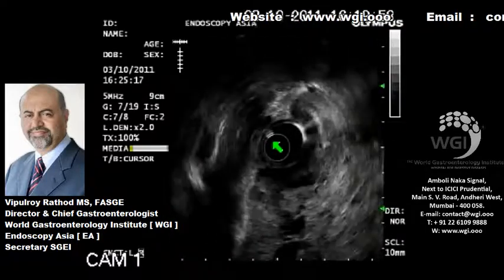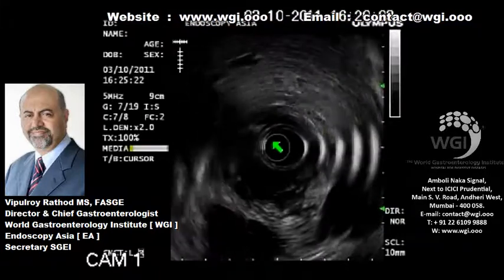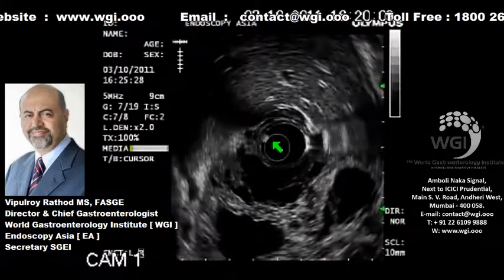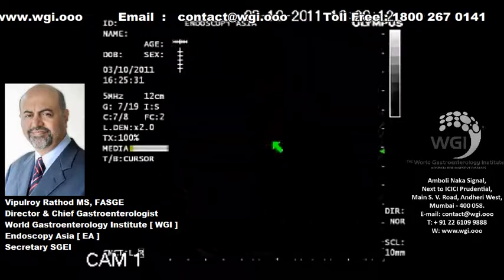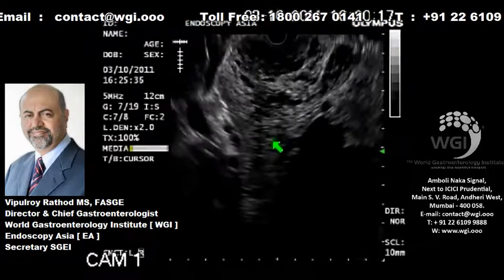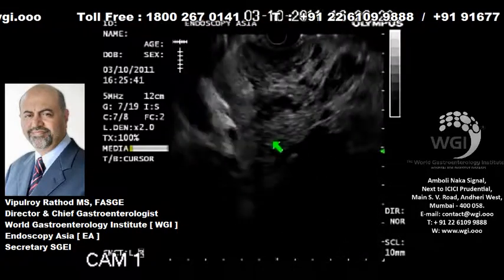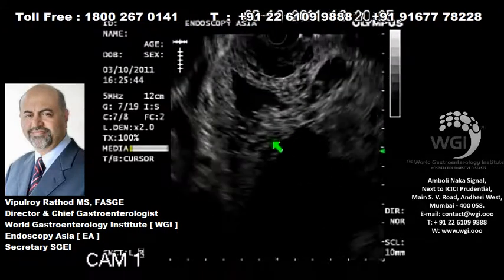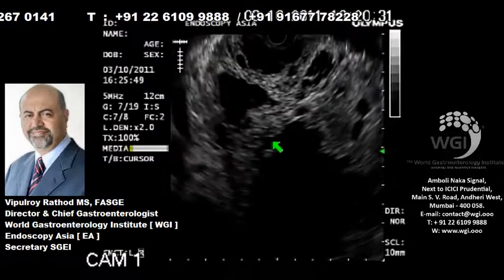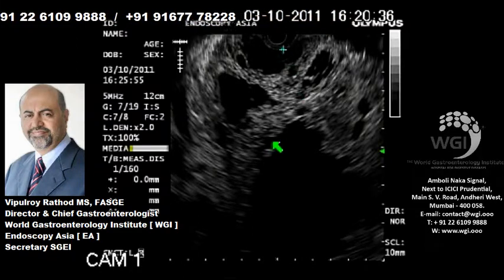And we have been requested to have tissue diagnosis for this patient, and therefore we will now proceed with EUS guided FNA from the so-called solid cystic lesion of the pancreas. So there are only two possibilities here, either a very large GIST lesion eroding into the stomach, but it's not very classical. We could not see pancreas so well. So my first diagnosis here would be a pancreatic lesion, unless proved otherwise.